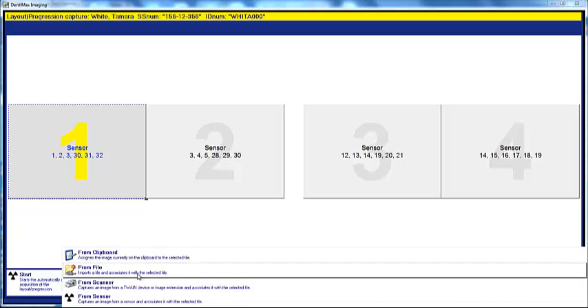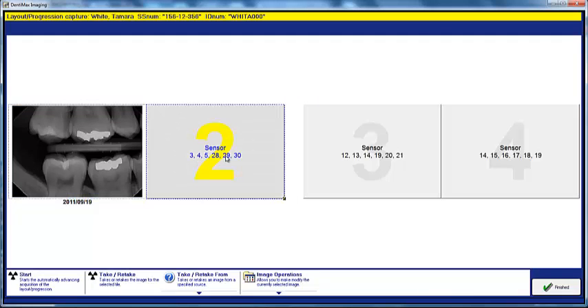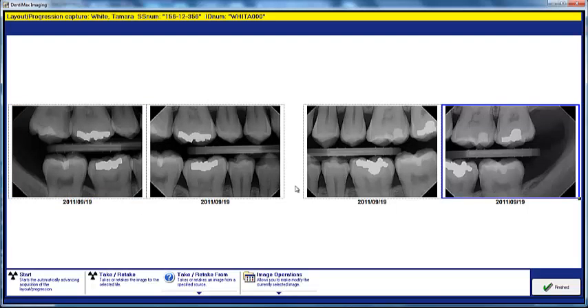I'm going to go ahead and import an x-ray to show you what it would look like — in the bottom right-hand molar here. And here we have that x-ray. The program will automatically sequence to number two, three, and four. You don't have to touch the keyboard or the mouse again. The program, as you take these x-rays, will know to go to the next sequence. If you do make a mistake, just like a digital camera, you can manually go back and retake an image to correct it.